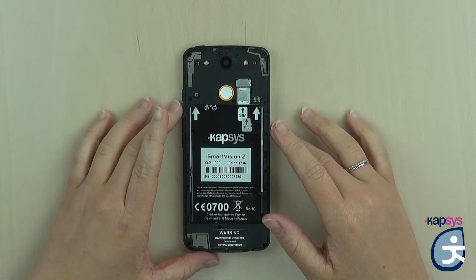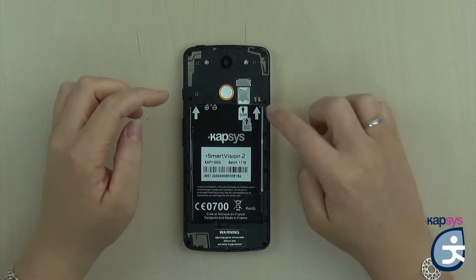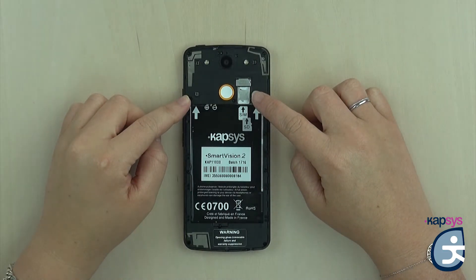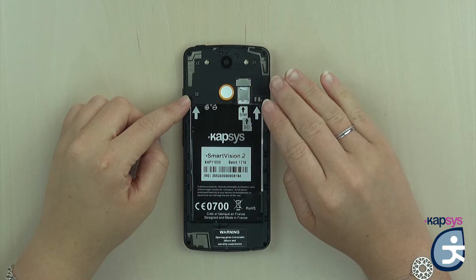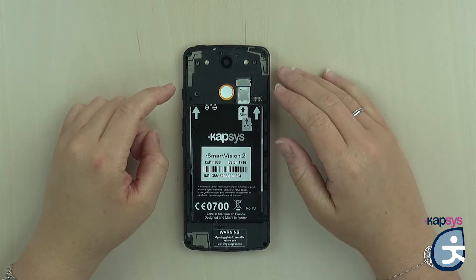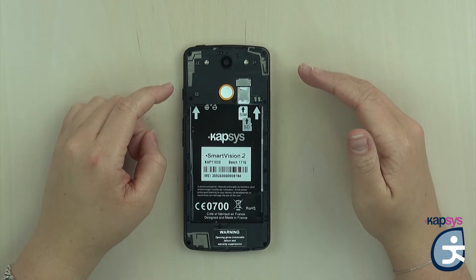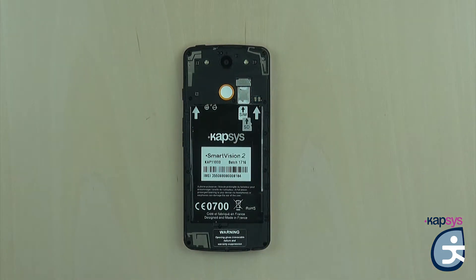Don't hesitate to get help from a sighted person if you have difficulty inserting it. Above is the micro SD connector where you can insert an extra memory card if needed. By default, Smart Vision 2 offers 16 GB of memory, but should you want to expand the memory, you can add an SD card up to 64 GB. This is particularly useful to increase multimedia content — for example, music, audio books, etc.